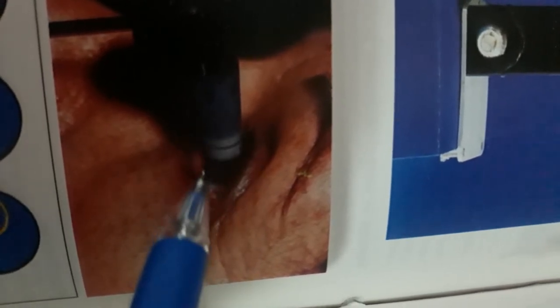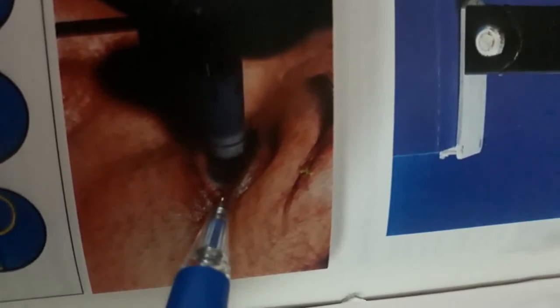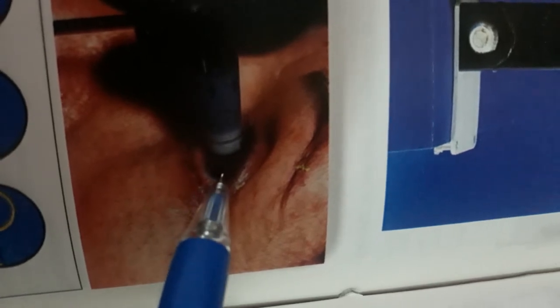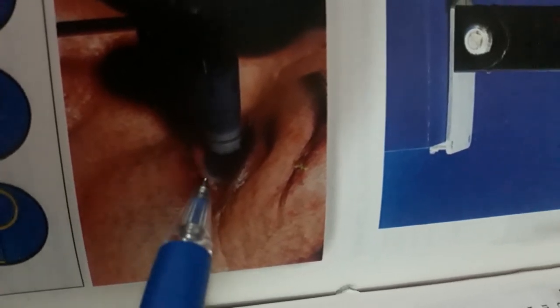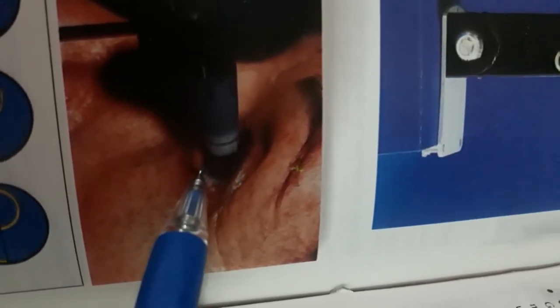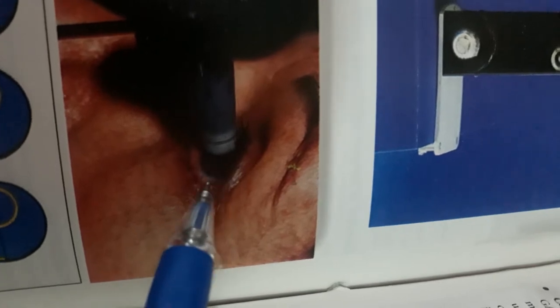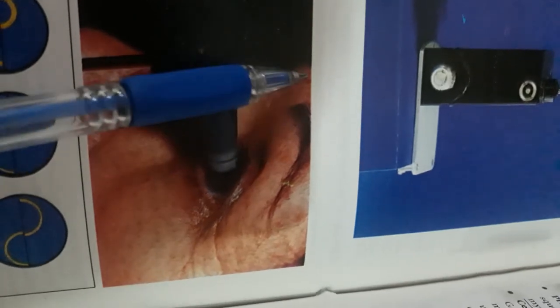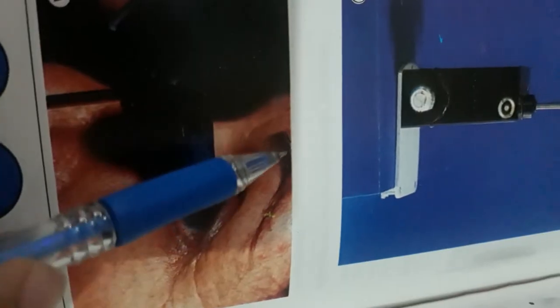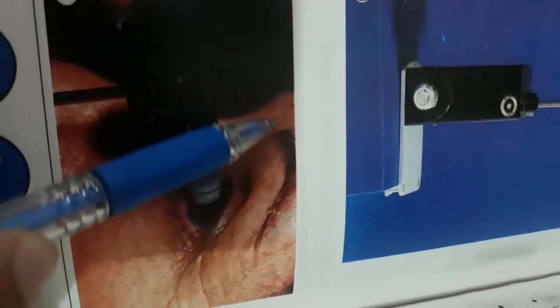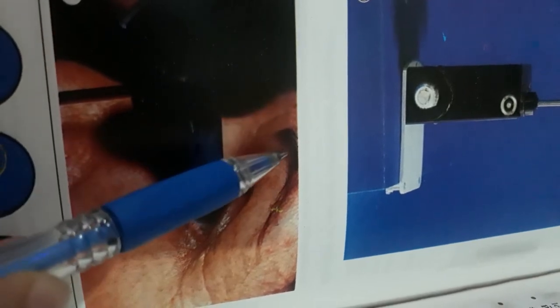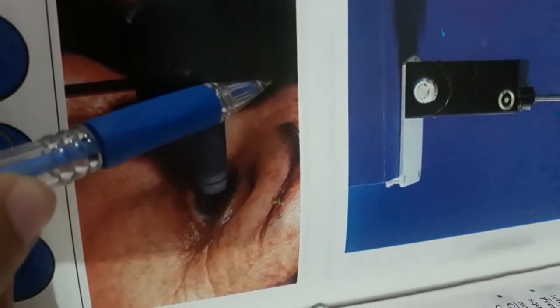Fluorescein is instilled into the conjunctival sac. The patient is positioned at the slit lamp with his or her forehead placed on the headrest.